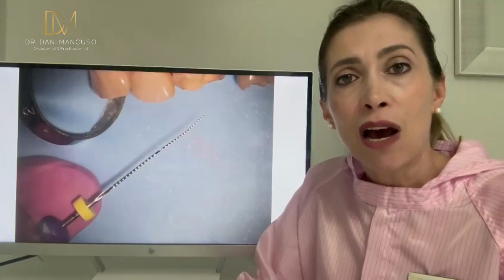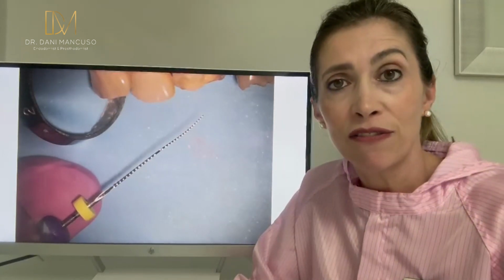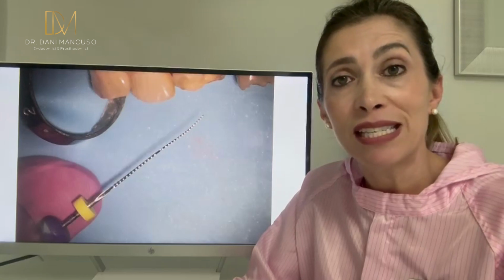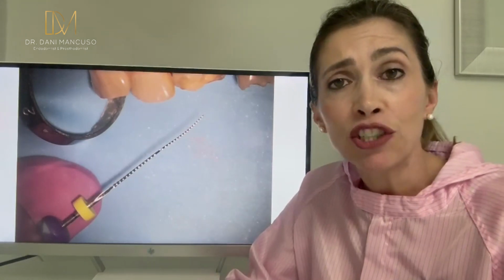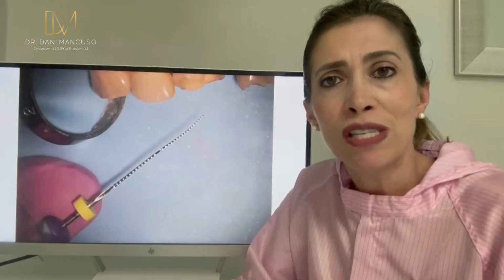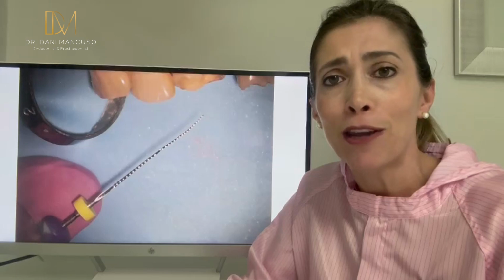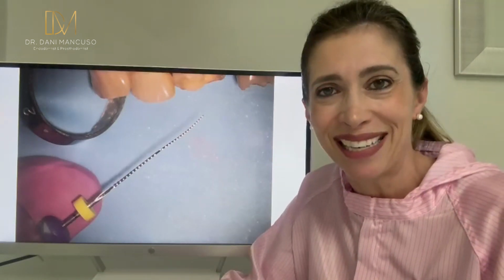When I was doing this scouting after the access cavity, remember that tooth was quite calcified, the canal? Well, there was distortion on my file. And it's important for you to see when you are doing scouting, the preparation of your canal, because if there is distortion, you don't want to use that file any longer, because it may separate, and it will make your life a lot more difficult than you are planning already.